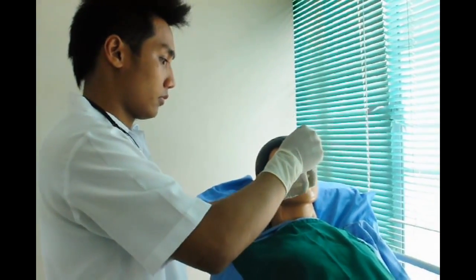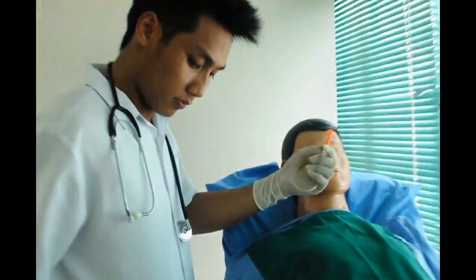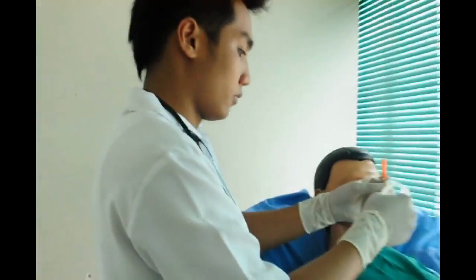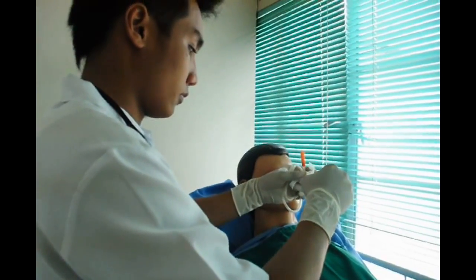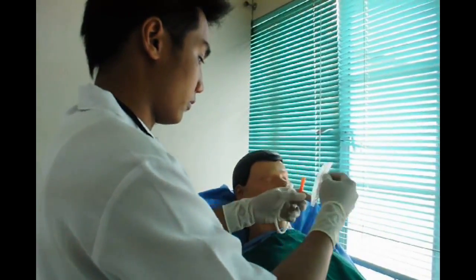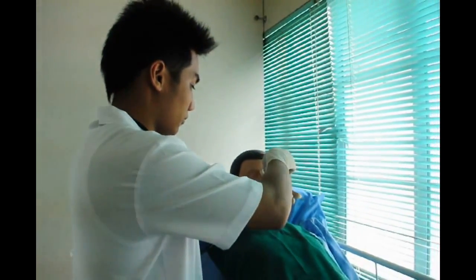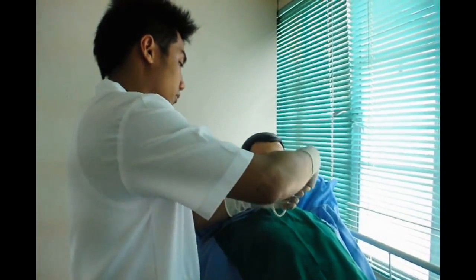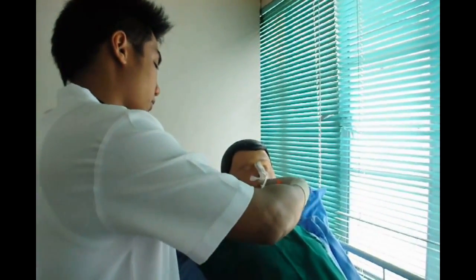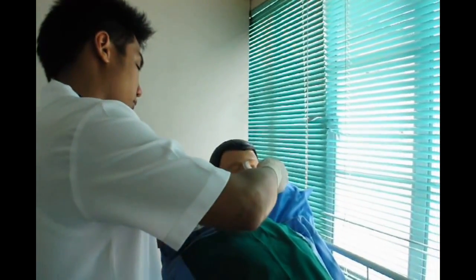Secure the tube by taping it at the bridge of the nose. Cut a 4-inch piece of tape and split the bottom 2 inches. Place the unsplit end on the bridge and wrap the split ends under the tubing. Be careful not to pull the tube too tightly against the nose. Constant pressure of the tube against the mucous membrane causes tissue injury.